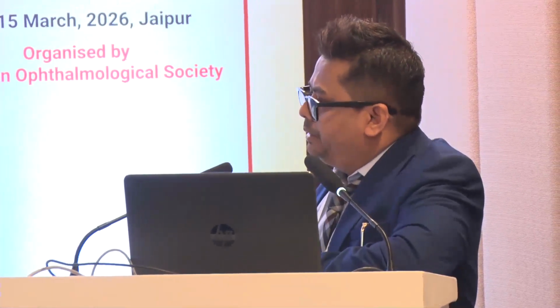This concept clicked in my mind even with LASIK. When we do the refractive correction, there is an improvement, and further, on follow-up, there is another improvement. Probably this second improvement is due to neurodevelopmental improvement. That indicates it probably has some role in phakic IOL in adult amblyopic therapy.